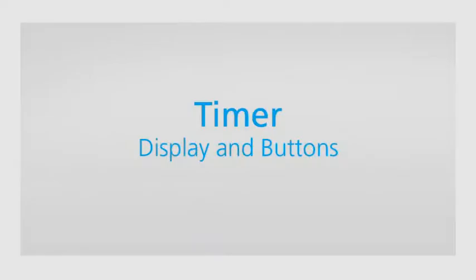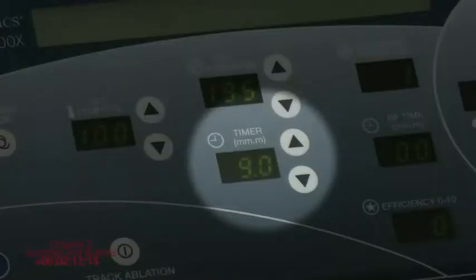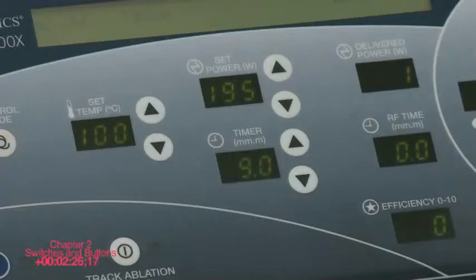Timer minutes display. Displays the time to a resolution of 1/10 of a minute. This display, prior to the start of RF energy, shows the time set for RF energy delivery at the target temperature. Once the RF energy starts, the display shows the remaining time of RF energy delivery at the set temperature. If the device temperature is not maintained at the target temperature, the timer stops. The timer resumes counting down once the target temperature is reached again.